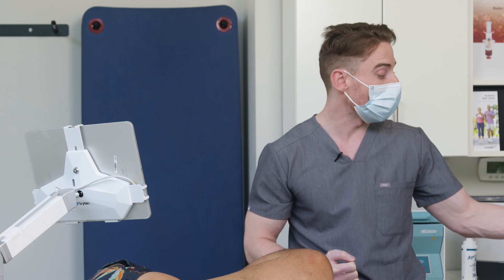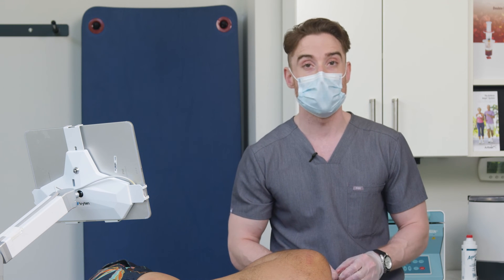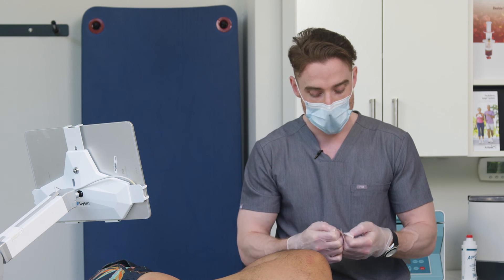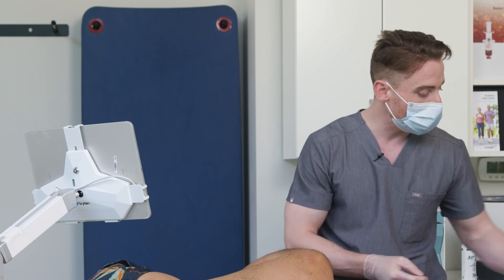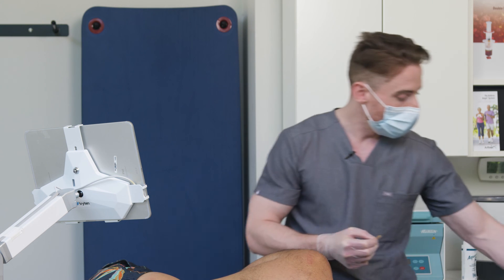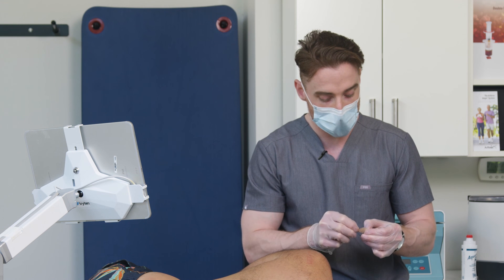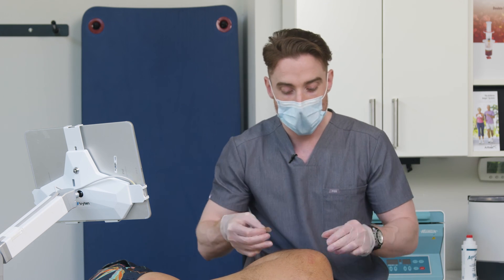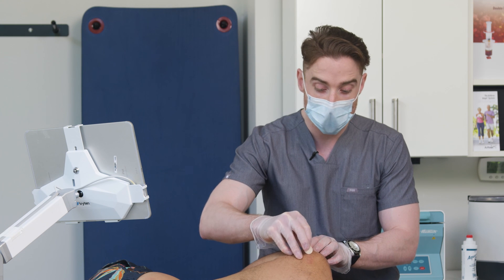Because this is PRP, I've explained to Jaden that there is going to be some minor discomfort over the next few days. This is an inflammatory injection, which is in contrast to cortisone, where it generally doesn't flare as commonly as regenerative injections. This is going to help strengthen soft tissue and hopefully move Jaden along in his experience with chronic shoulder instability.